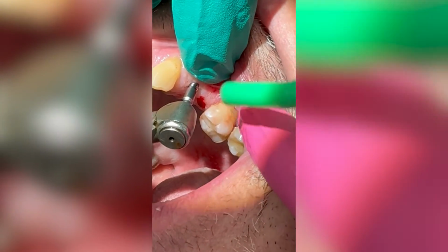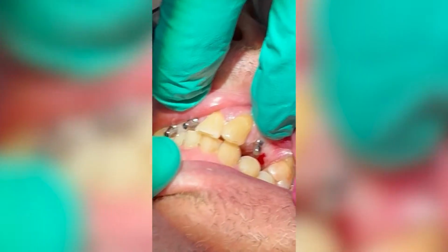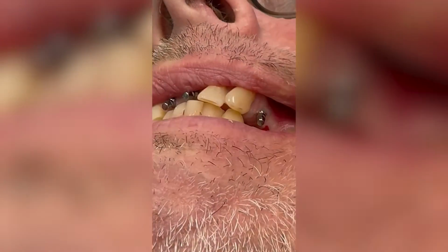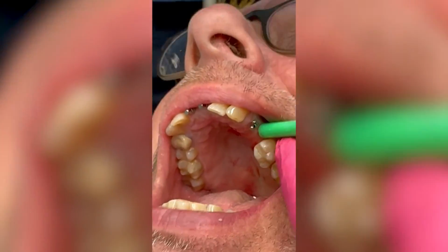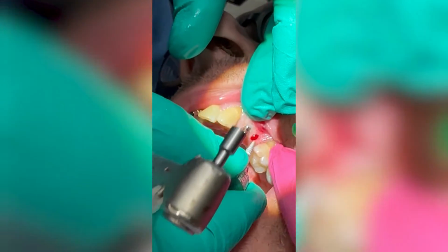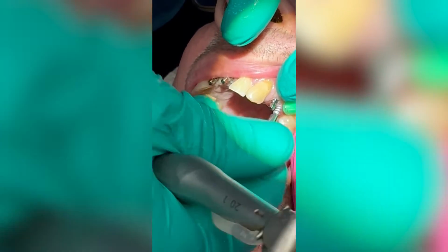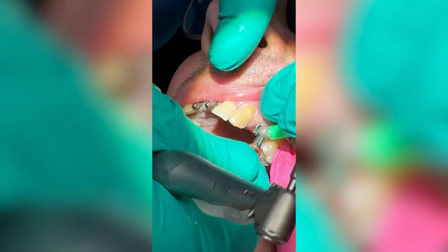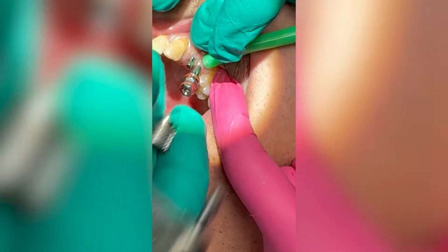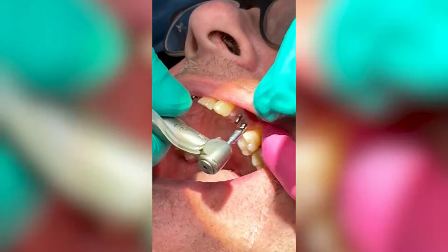And close gently. Close together. Okay, there's enough clearance there. We'll do the next one. And here's the other one. This is where the more recent extraction was, so the bone's not quite as dense in that spot. But I think we're going to be just fine.